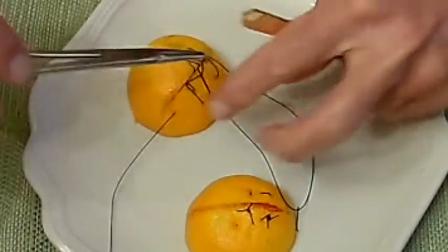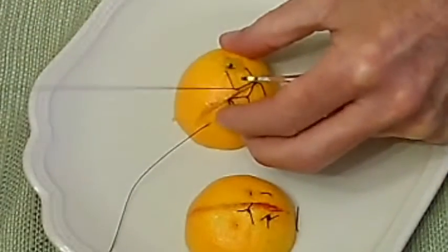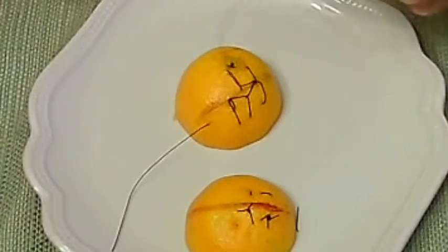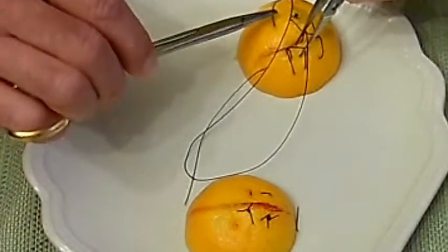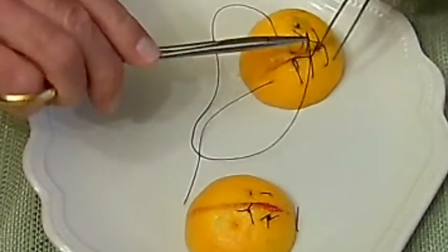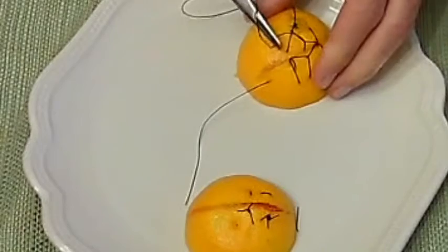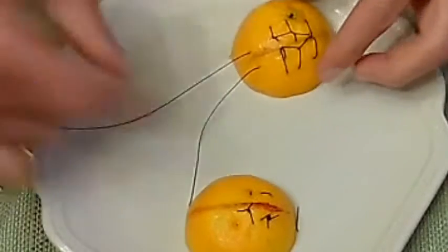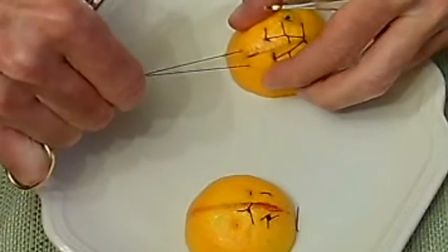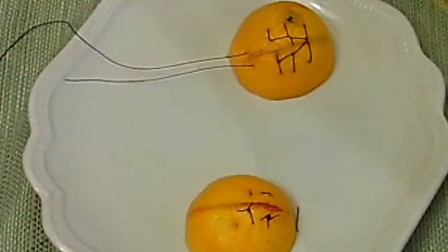You pull it through — it has to go through the previous loop — and when you pull it through, it's a locking suture. I made three passes on one side, three on the other. On a real tendon I'd usually use three or four passes; if it's a really degraded tendon — like a long Achilles that was all mush — I might use five or six loops going all the way up. Use your judgment. Same thing applies for a patellar tendon. Once you get that in, you bury it longitudinally through the moppy portion of the tendon. That's the Krakow locking suture — very, very strong. It'll squeeze that tendon before it pulls out.